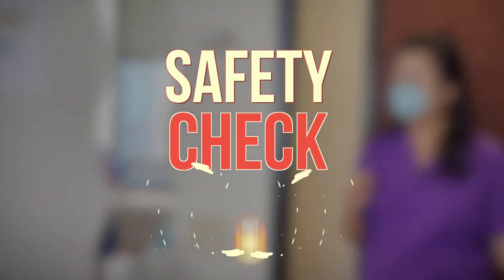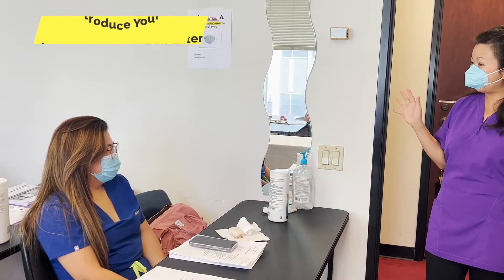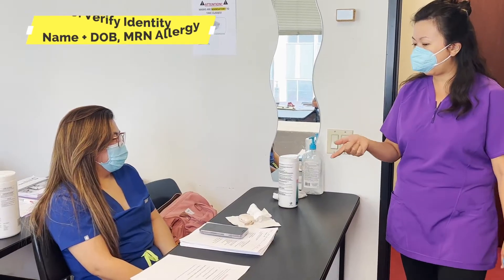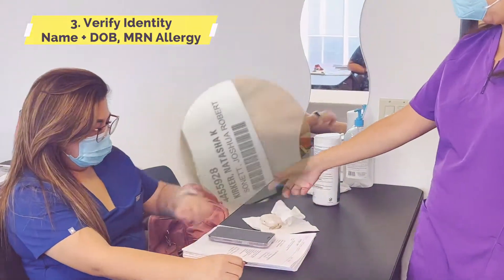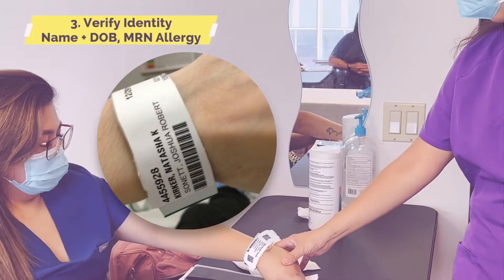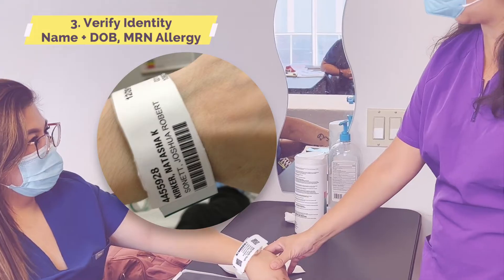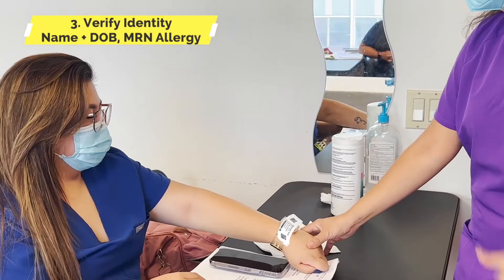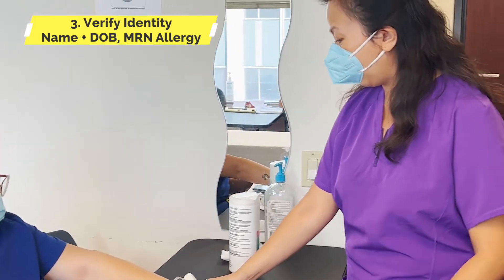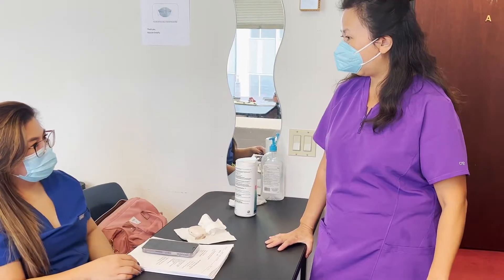Come in. Hello. Hi. Good morning. Good morning. My name is Olympia. I'll be your nurse today. Can I go ahead and check your ID band, please? Yeah, sure. Right here. I just want to know you're my correct patient. Can I have your first name and your last name? And you can just say secret for your birth date. March 3-5-1996. Okay, wonderful. You're the right patient. It says right here, no known allergies. Is that correct? Yes, that's correct.